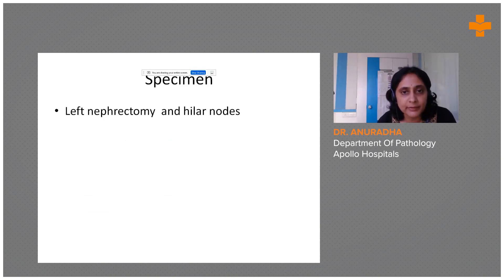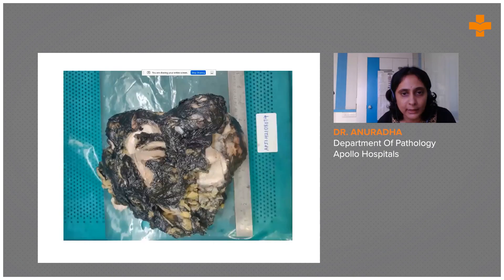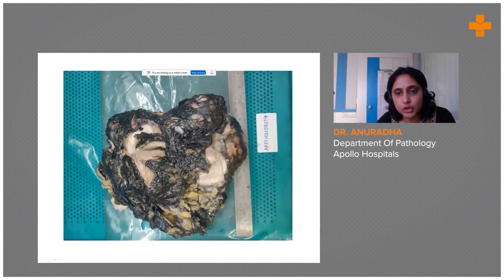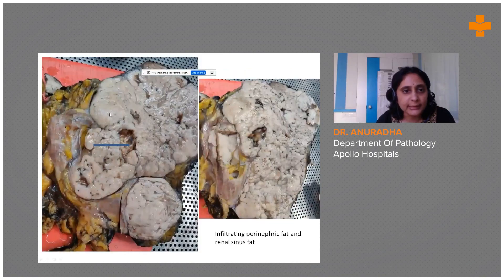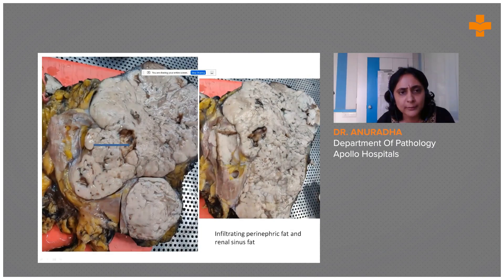We received a nephrectomy specimen along with the hilar nodes. As we can see here, there is a quite large tumor with a bosselated appearance and adherence to the capsule.